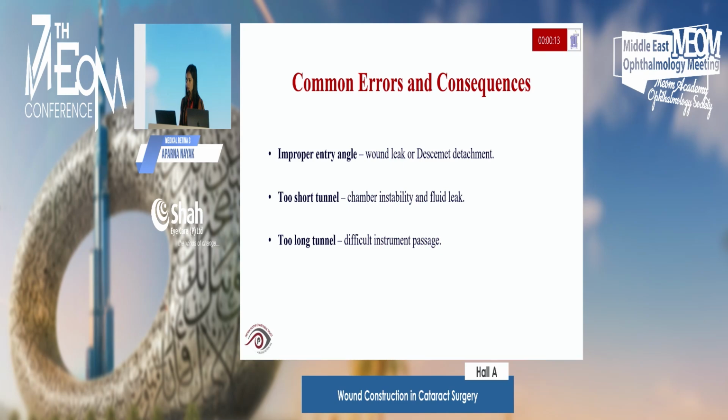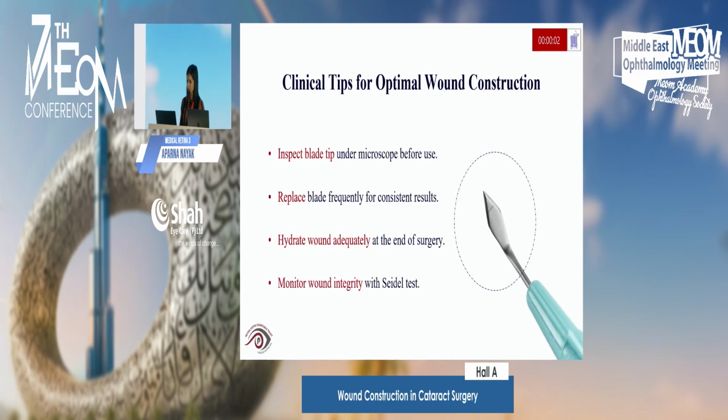So these are some common errors and consequences. An improper entry angle can cause wound leak or DM detachment. Too short or too long tunnels also can cause other complications. So always inspect the blade tip.